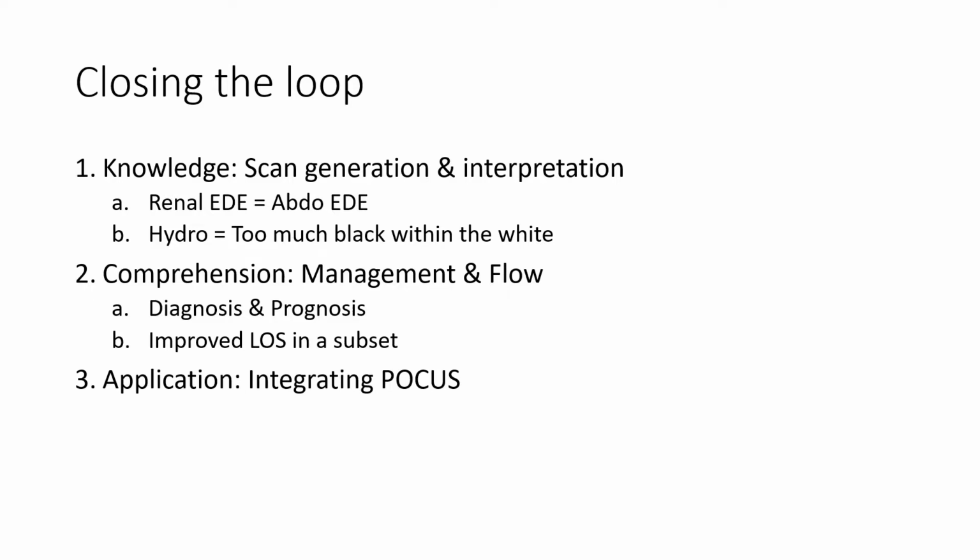If you are going to make maximum use of renal EDE in kidney stone patients, you'll want to decide to pick up the probe from the get-go, right from when you read the triage note. If you do not do your scan at first touch, you're just less likely to use it.